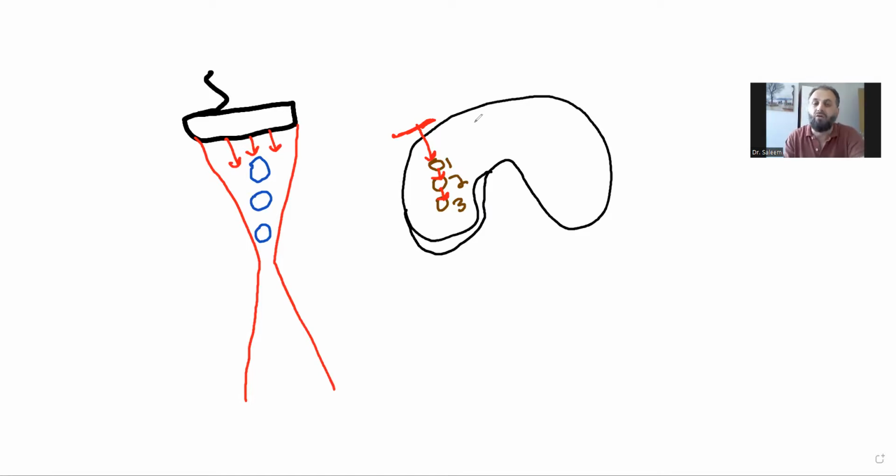That is important. Now, for example, if I want to look at something very serious, for example, this is a thyroid tissue. In this thyroid tissue, there are three structures, three masses, three nodules, three tumors. I don't know, but there are three masses. Let's put it as mass. To know the very detail of these nodules or these masses, what they are, what their structure is, what their echotexture is, how they look, because we want to get close to the diagnosis. And also, we want to know the numbers of them. Is it 1, 2, 3, 4, 5, multiple?